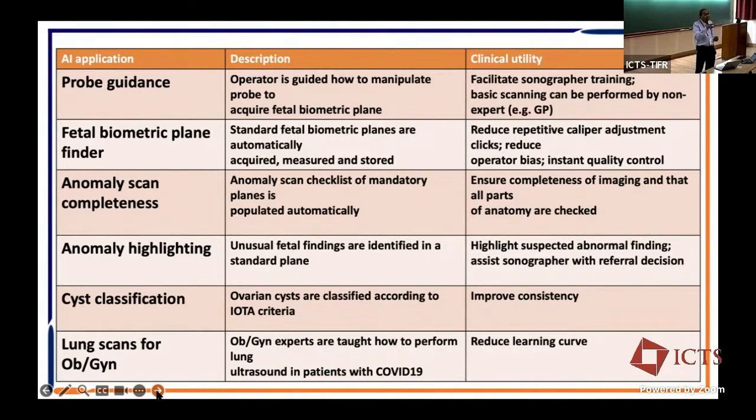But today, if you want only limited information in remote areas, let us make a black box, right? There will be no machine, no monitor, nothing. You take the probe, and the doctor is asked to move the probe through particular sections, 3 longitudinal sections and 3 horizontal sections.